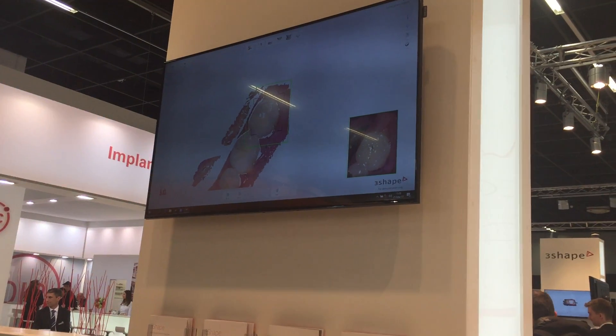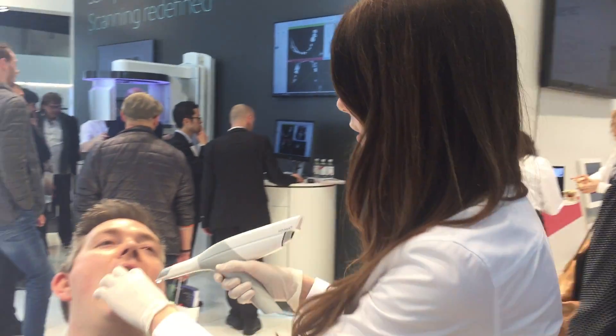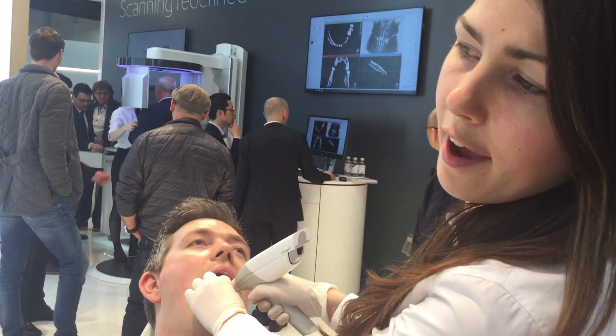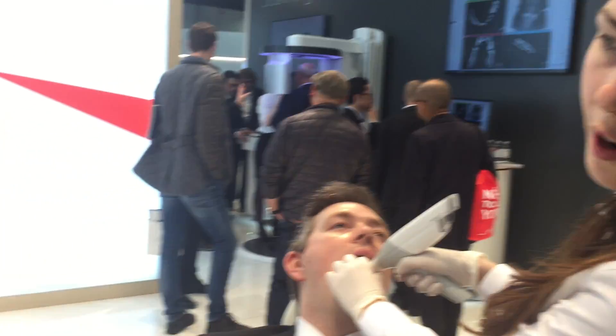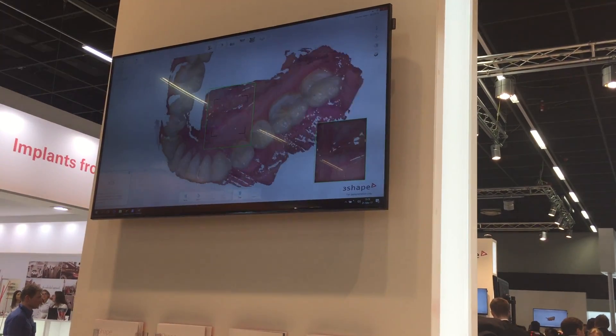You can easily move, and if you need to, you can actually take the scanner out of the patient's mouth, do any operation that you need, and then start scanning. It will capture automatically the area wherever you have already scanned. So then you just keep scanning.